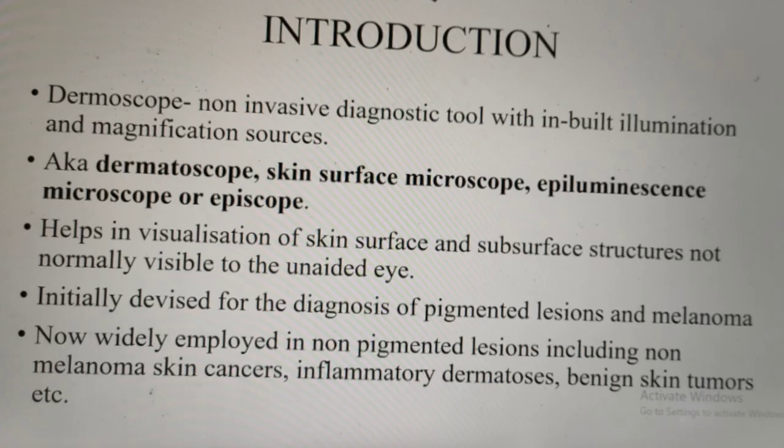Dermoscope is a non-invasive diagnostic tool with inbuilt illumination and magnification sources. It is also called as dermatoscope, skin surface microscope, epiluminescence microscope or episcope. It helps in visualization of skin surface and subsurface structures which are usually not normally visible to the unaided eye.